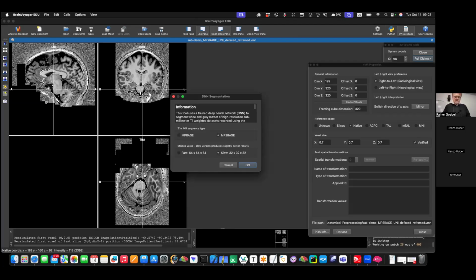I have a question about this. Does it segment each patch independently, or does it also take into account the relative positions of the patches? Independently. As I said yesterday, it has the 64 by 64 by 64 cubes of the data, goes through these cubes and sends each one. So for each voxel, it has the local neighborhood, but not outside the cube. In that sense, each cube is independently segmented.